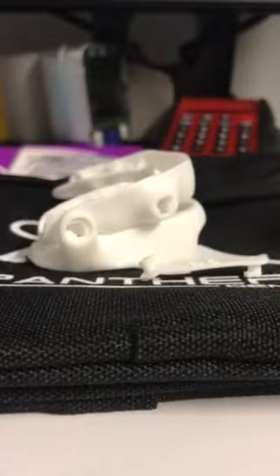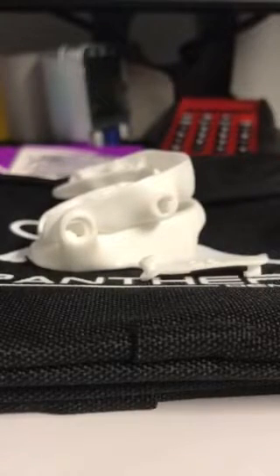Hello again, it's April the Sleep Chick with Sleep Dallas and I'm going to show you how to put on the Panthera style strap on the device.